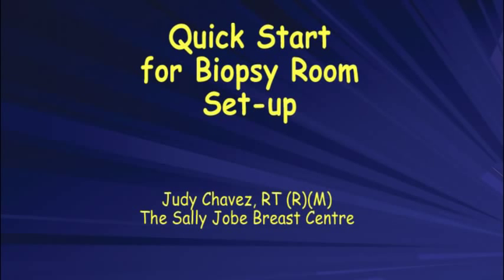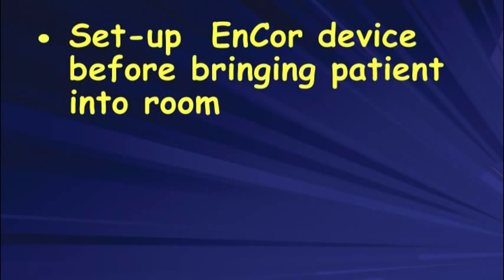Welcome everyone. I'm going to share some tips on setting up the Encore machine. We tend to do all this setup before we bring the patient into the room — it just makes things a little friendlier for the patient, and we keep everything covered up to make sure we don't have any problems.